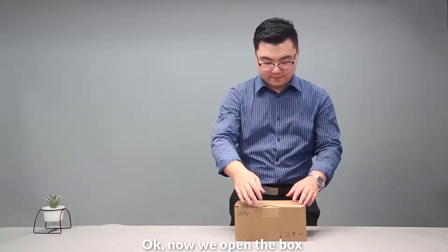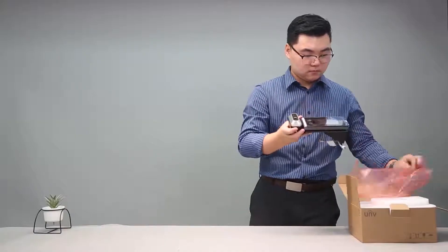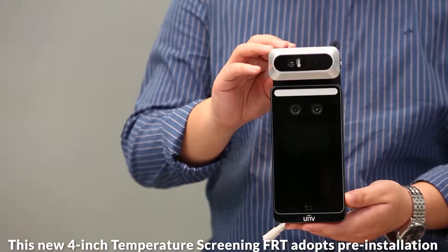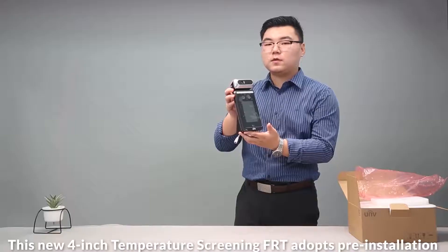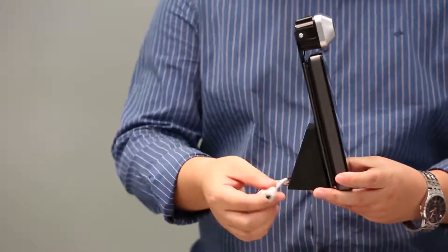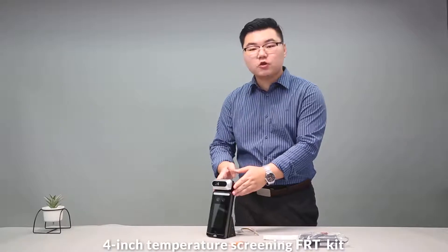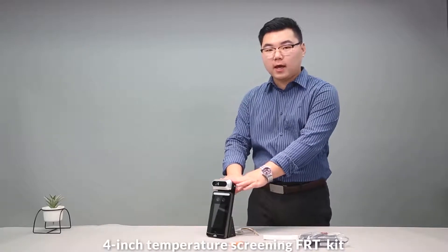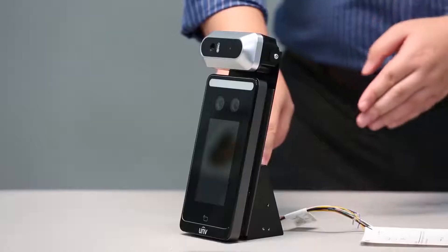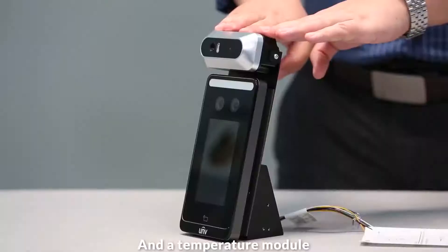Now we open the box. As you can see, this new 4-inch temperature screening FRT adopts pre-installation, which is truly pleasant. Inside the box, we have a 4-inch temperature screening FRT kit, which consists of a terminal, a desktop stand, and a temperature module.